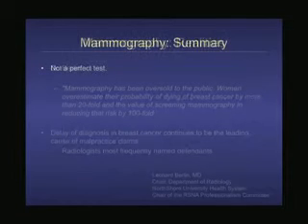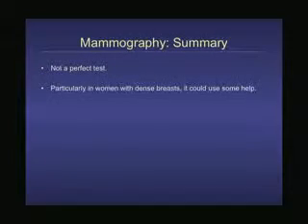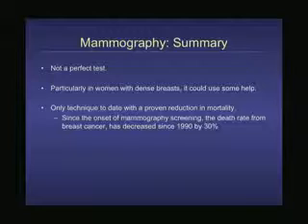Okay? So, in summary, it's not a perfect test, particularly in women with dense breasts. We could use some help. We could use some other ways to image the breast. But it's the only technique to date that has shown that it can reduce death due to breast cancer. And since the onset of mammography screening, the death rate from breast cancer has decreased since 1990 by 30%, whereas in the preceding 50 years, there was no change in mortality.